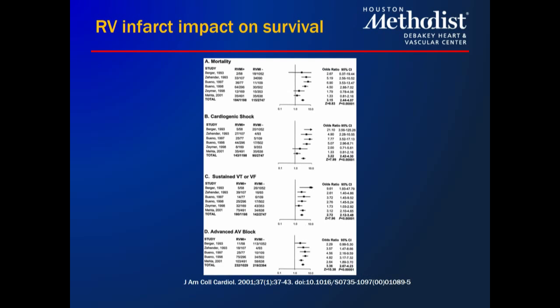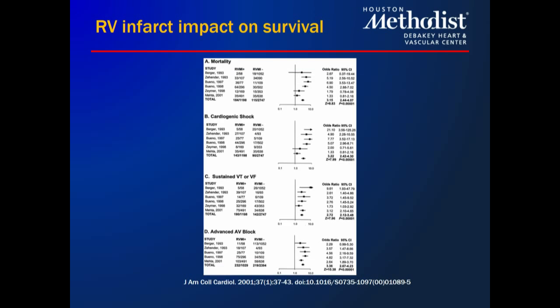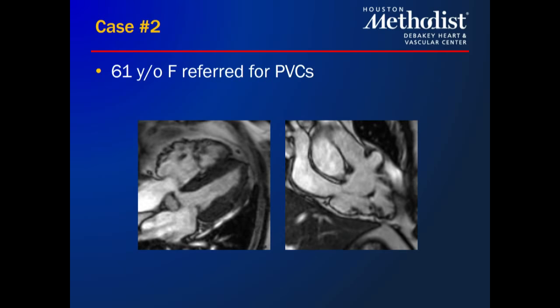Okay, and just flying through it. If you do detect RV infarct, this does have prognostic significance. It does impact six-month mortality in these patients as well.